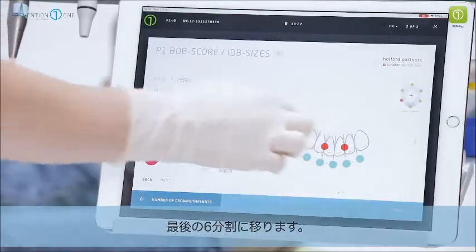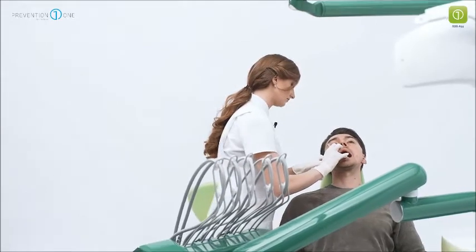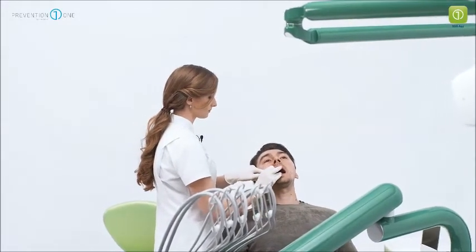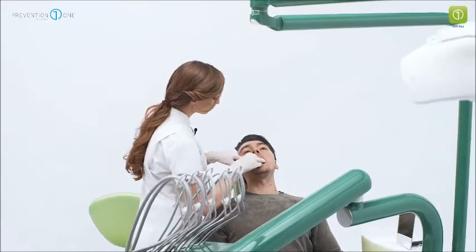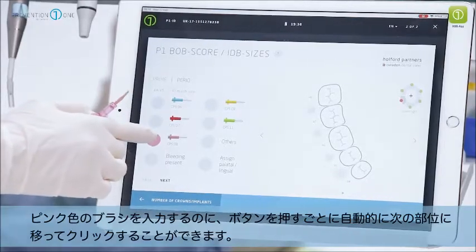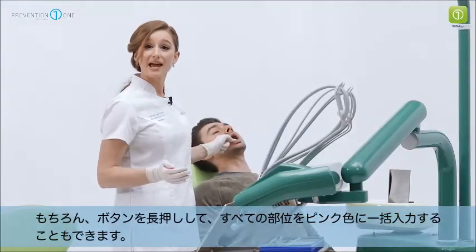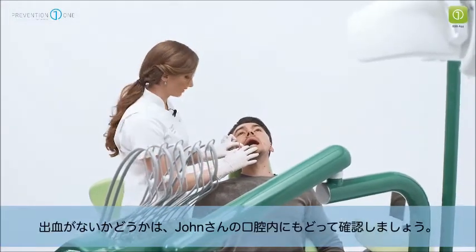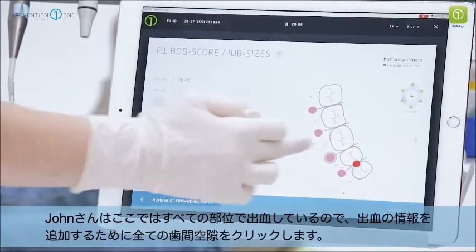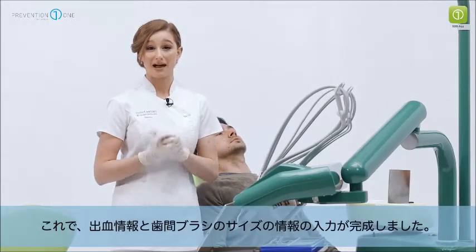John needs to use the turquoise prime brush on the lower anterior sextant. By clicking and holding the turquoise button it automatically infills all interproximal regions with the turquoise prime brush. Referring back I can see if there is any bleeding to input into the chart. Moving to the last sextant, John needs the pink prime brush in the lower right sextant. By holding the pink button down I infill all areas, then refer back to John to check for bleeding. As John has bleeding in all areas I click each interproximal area to add it. We have now completed the interdental brushing mouth chart with the bleeding index.